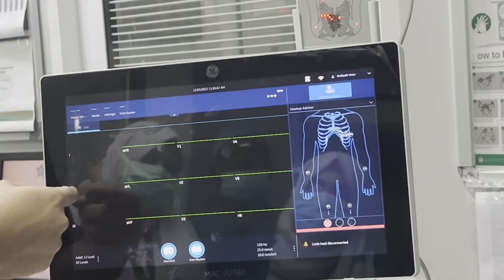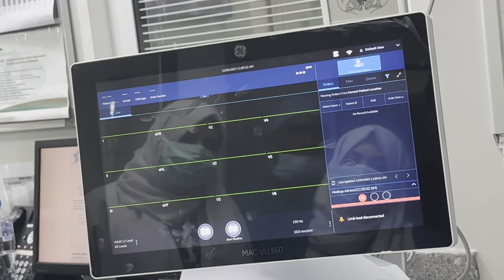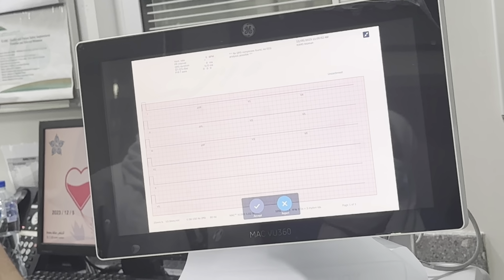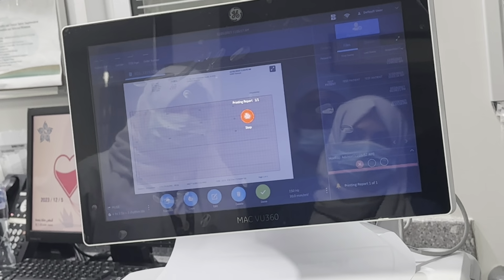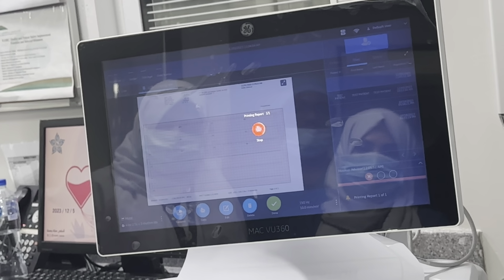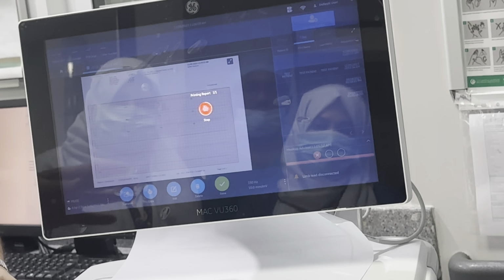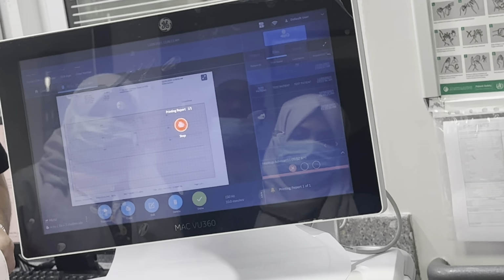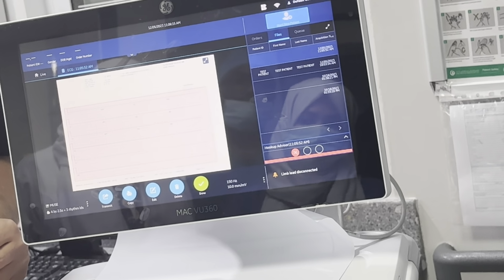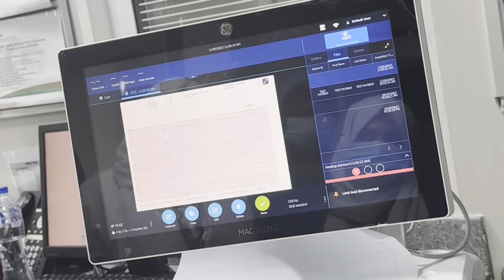So this is my patient here, and I have an emergency case. Let's do an ECG for this patient. Accept. Transmit later. I will do the ECG and take that copy. I will do the fast management for the patient, and I will keep the copy with me. When I get back, after finishing management of my patient, with the copy I have, I will go back to my physician and ask him to place an order in the system. I still have the copy with me.